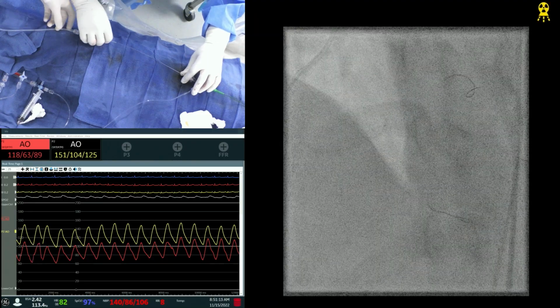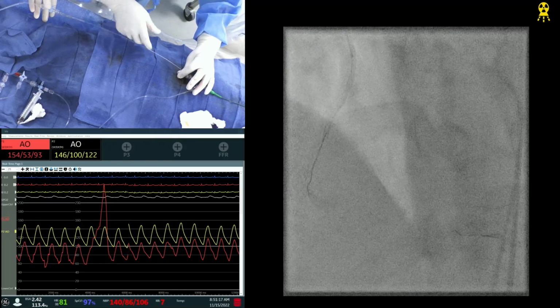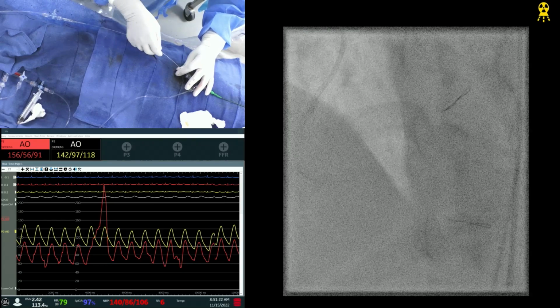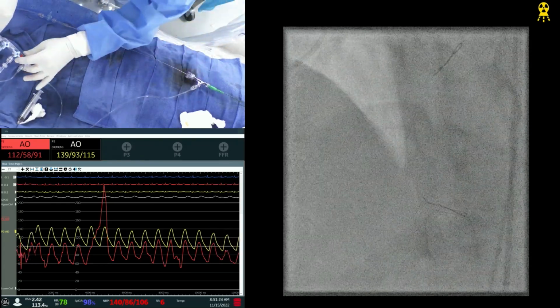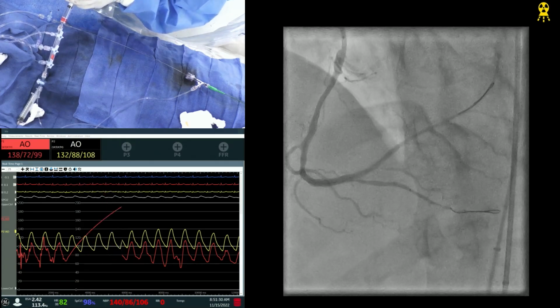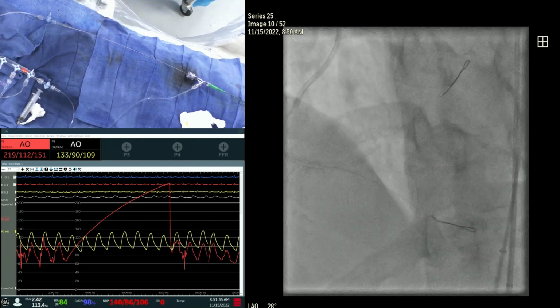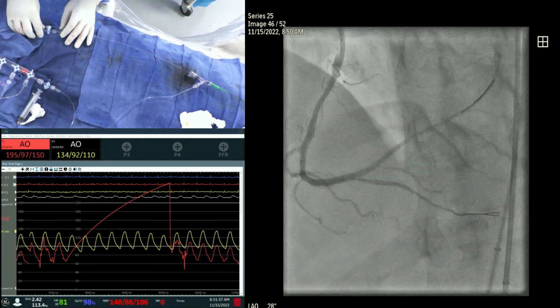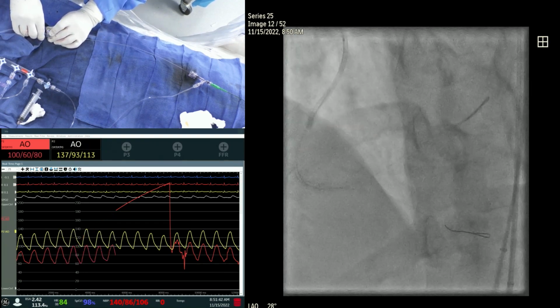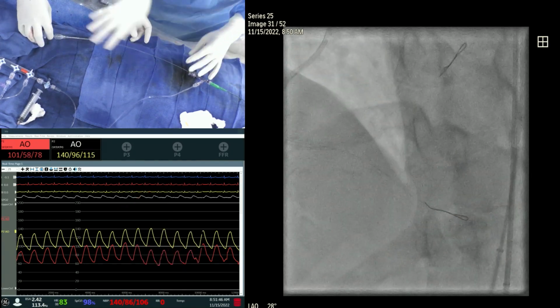Give me a pen. And so the wire came out, which is okay. Good. So we do an antegrade injection. Which wire came out? No, nothing. All good. Don't touch it. Wait. Yeah, here. Looks very good. There's a little dissection at the ostium, which we expected. But so far, nice. The AV continuation has plumped up with a lot of disease downstream, which is okay. So let's take this out and put a stent now.